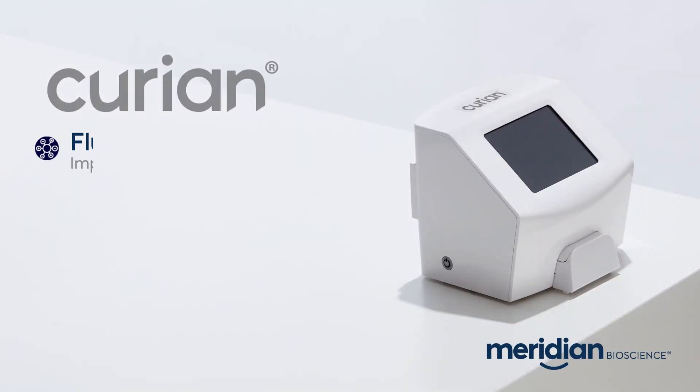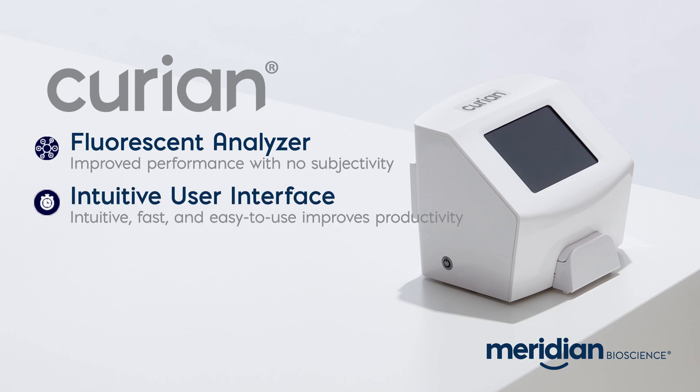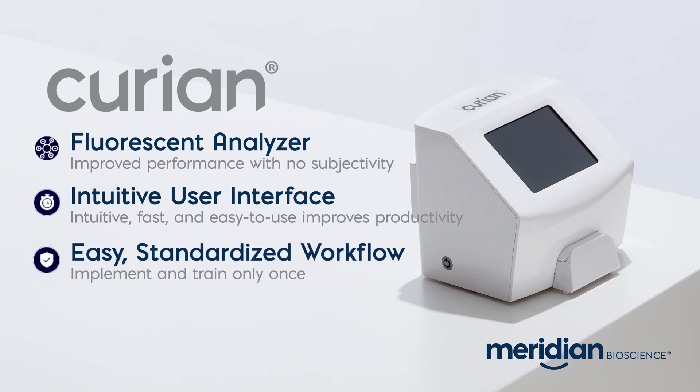A fluorometric analyzer not only helps to eliminate subjectivity by reducing operator-to-operator variability, but improves performance with the ability to produce higher sensitivity and specificity with a lower LOD. The intuitive user interface is fast, easy to use, and improves productivity. Every Curian assay features the same easy standardized workflow and less than one minute's hands-on time.